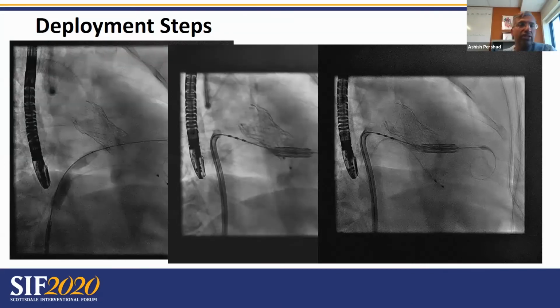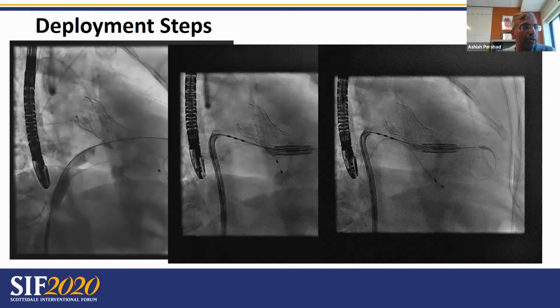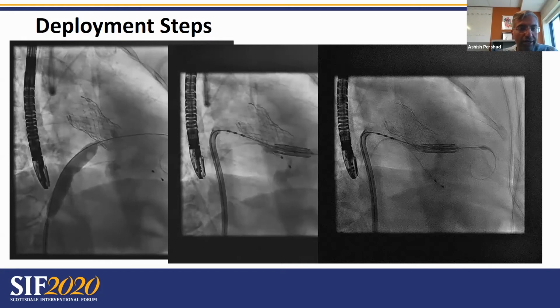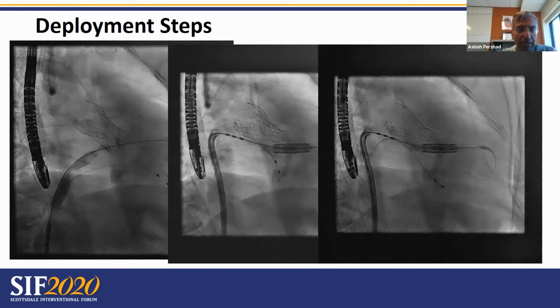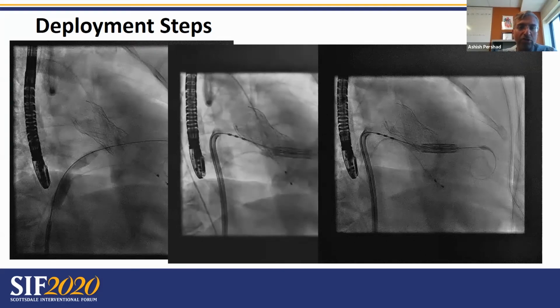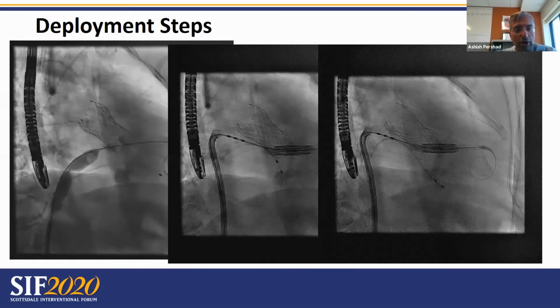So going back to our case, we clearly have to dilate the septum. We typically will dilate the septum using a 14 millimeter balloon, like you see in the left panel. The transseptal has to be targeted, similar to most mitral procedures, whether it be valve and ring, valve and MAC, or valve and valve, where the access to the left atrium is posterior and inferior. We use transesophageal echocardiography for all our targeted transseptal punctures.